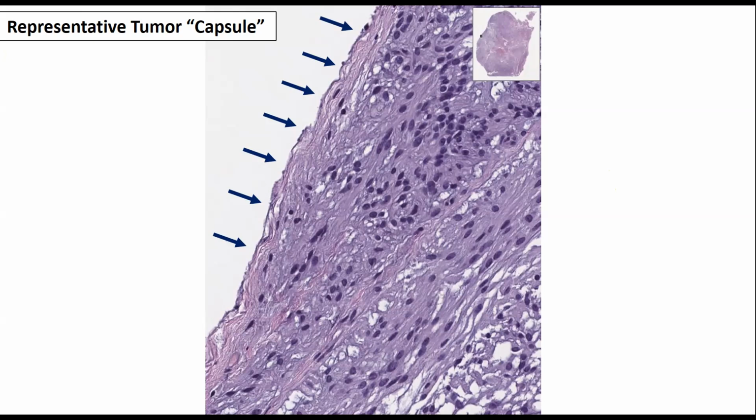It's already spread. Typically, the way that you will see that with myxopapillary ependymoma is you look to the very bottom on the spinal cord imaging. Look at the very bottom of the thecal sac, and just because of gravity, if you see contrast enhancing stuff down there, that's going to be disseminated myxopapillary ependymoma growing. Sometimes there will be nodules on the roots of the cauda equina. That's dissemination. That can happen before the patient even presents. It's a big problem, unfortunately.